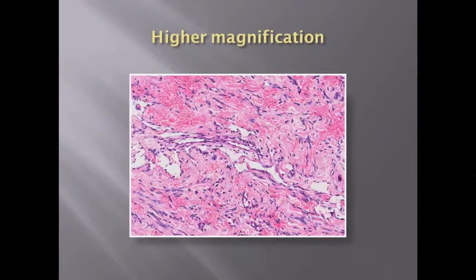When you see dermal vascular proliferation, that is quite well defined. If you see a hemangioma, that is a localized proliferation of small cells, small vessels, sorry. But here you find that these endothelial cells are, although bland, the dissecting nature of these vascular channels is very, very abnormal.